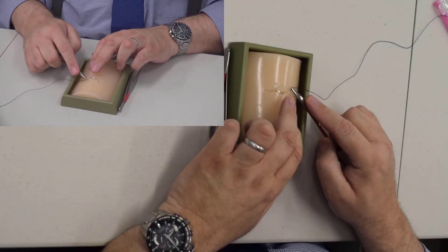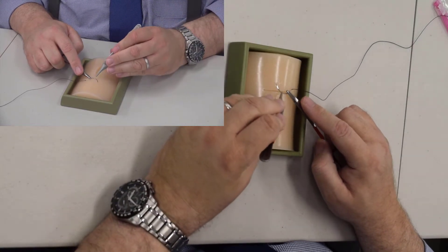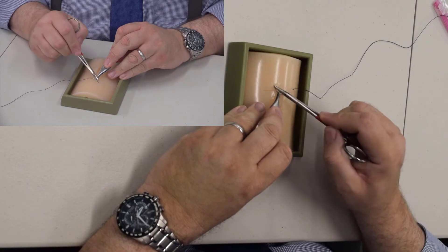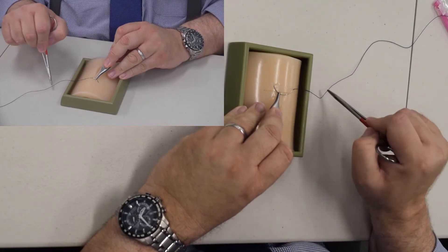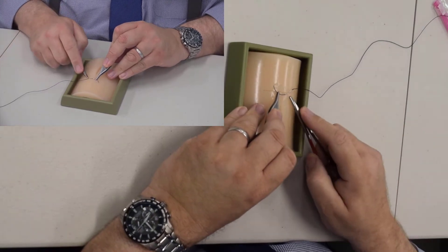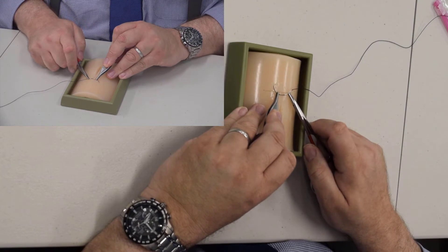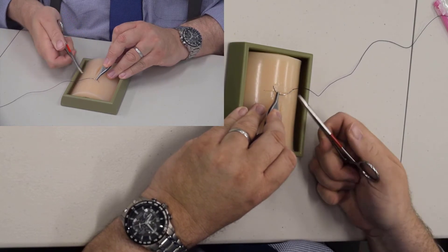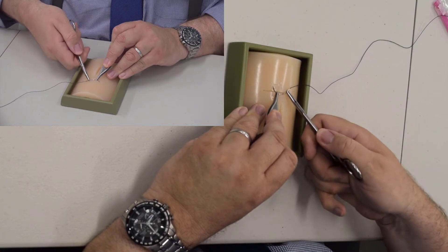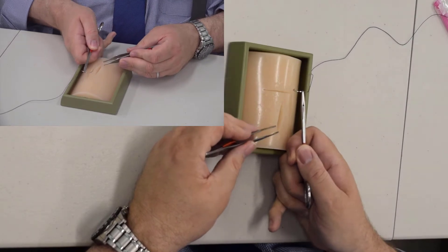Every needle has an inflection point. The inflection point — if you remember from first-year calculus — is where the curve goes from curve up to curve down or vice versa. On a needle, this is the inflection point right here. In theory, that's the strongest point of the needle and you're supposed to load it there, but I never do.